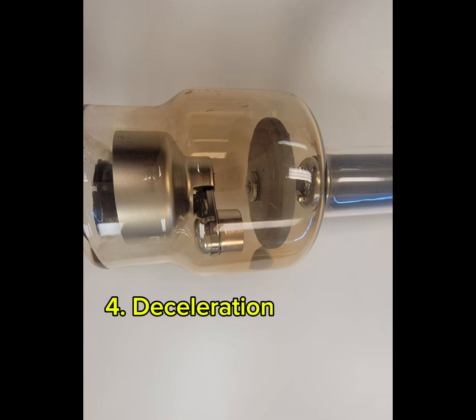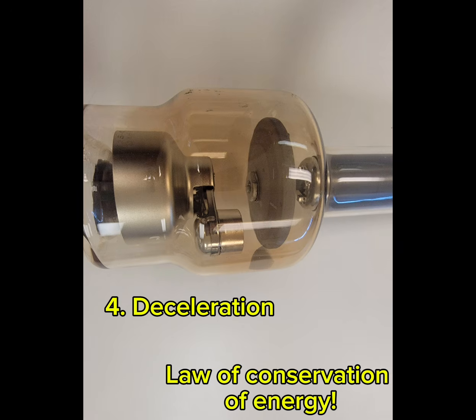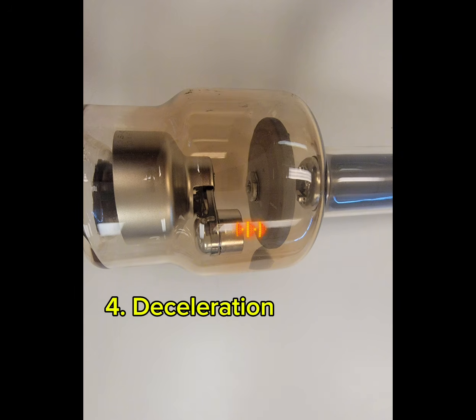Step 4 is deacceleration. Remember the law of conservation of energy. Energy is not created nor destroyed, it can only transfer forms. So as our electrons are traveling across the tube gap at an insanely high energy, they're going to slam into our positive anode, and therefore all of that energy needs to go somewhere, and that takes us to step 5.